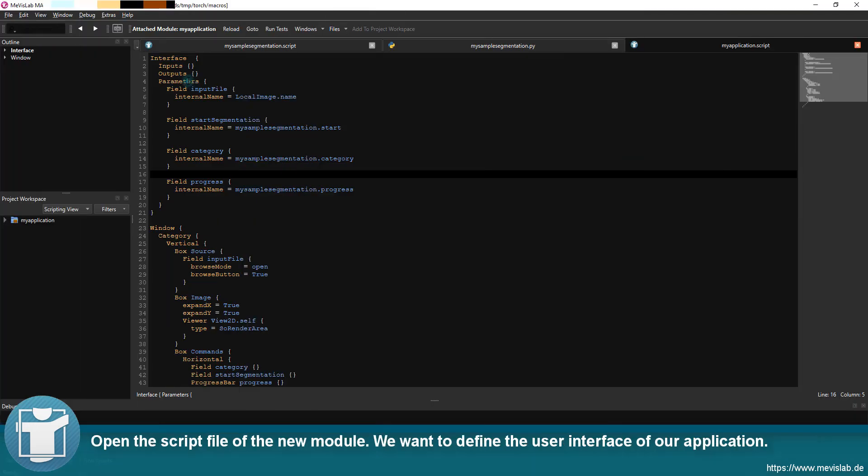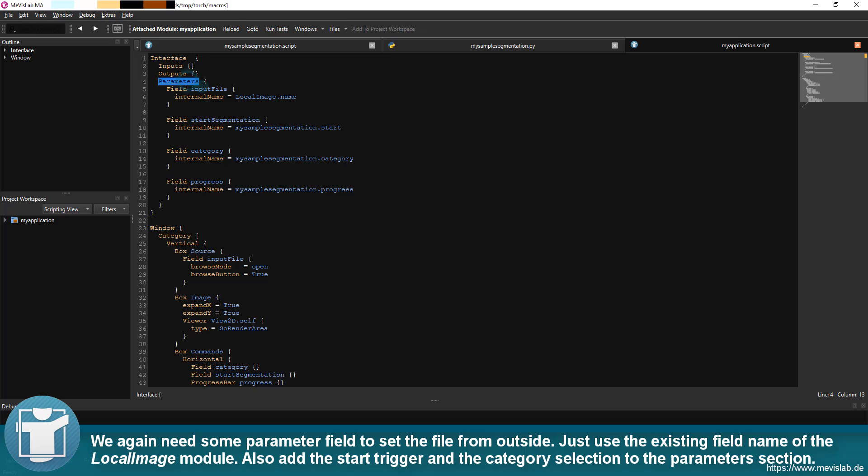Open the script file of the new module. We want to define the user interface of our application. We again need some parameter field to set the file from outside. Just use the existing field name of the local image module.